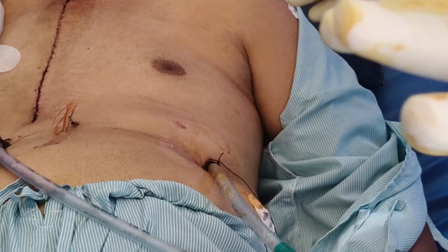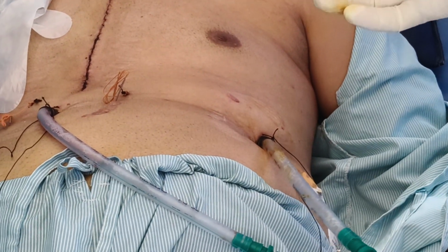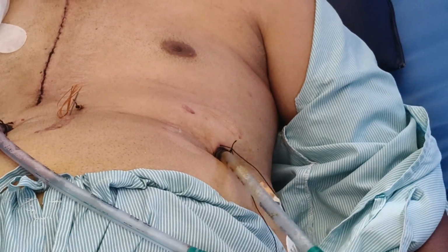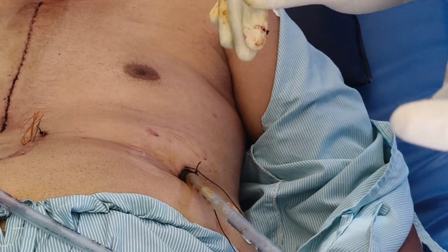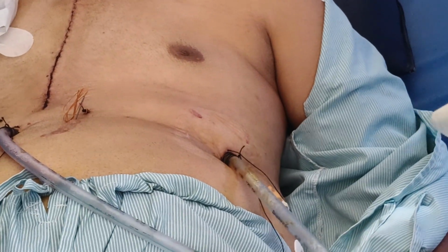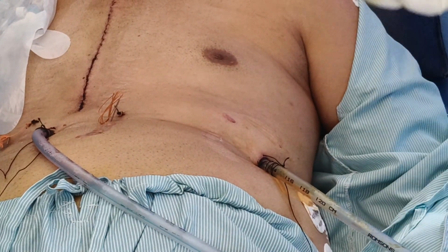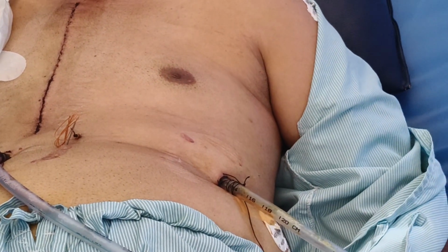So first you have to instruct the patient, then you have to make sure that he understood the instruction. Hindi aata hai? Try before you pull the. Tamil aata hai? Tamil. Who is Tamil? Tell him he has to take a deep breath in, as deep as he can take, and hold it.